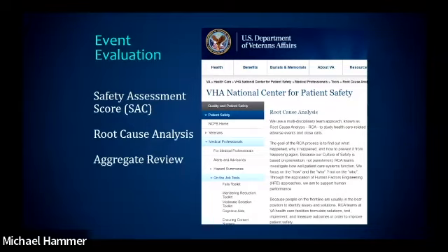And then we are able to look at aggregates. So when we see falls from power wheelchairs over time, we can look at a summary of that information and see if we can identify themes so that we can identify the appropriate strategies to address those issues. If individuals are not performing well in their wheelchair, and we identify the theme that we're not providing appropriate skills training for operating their wheelchair, then we can create an implementation to address that challenge. So that's what we do in our system.